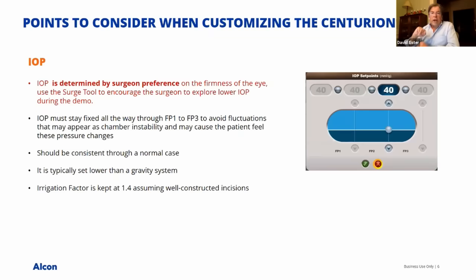The other thing that we're able to manage because we've reduced surge and we can manage constant IOP in the eye, being able to now operate at lower IOP probably provides greater patient comfort. Greater patient comfort, we hope, will impart less movement of the patient, less concern of the patient, and keep everybody relaxed within the OR. Next slide.